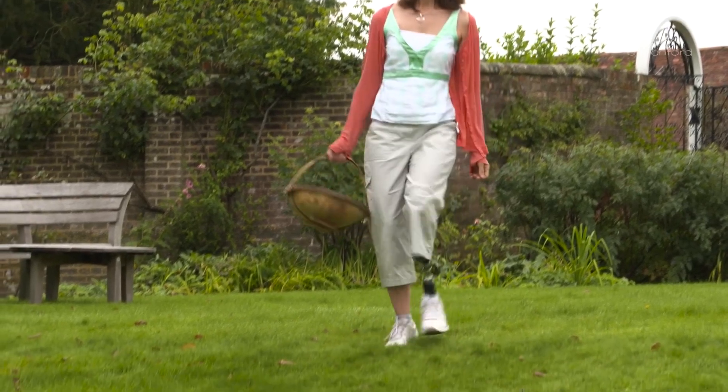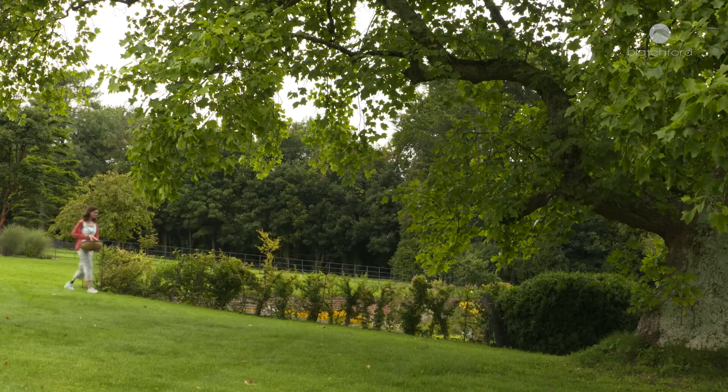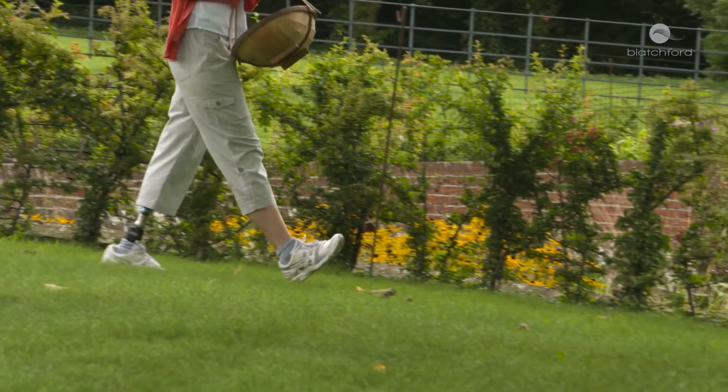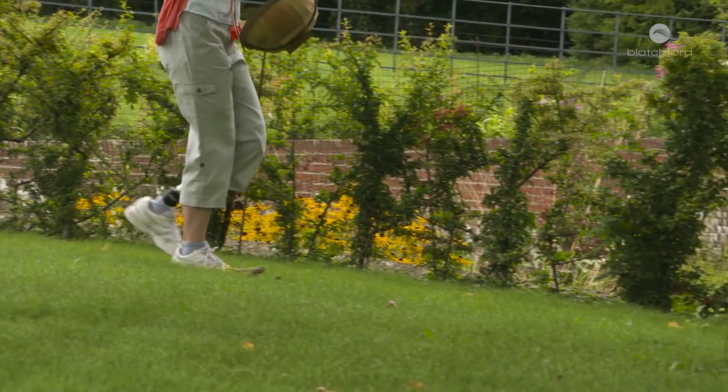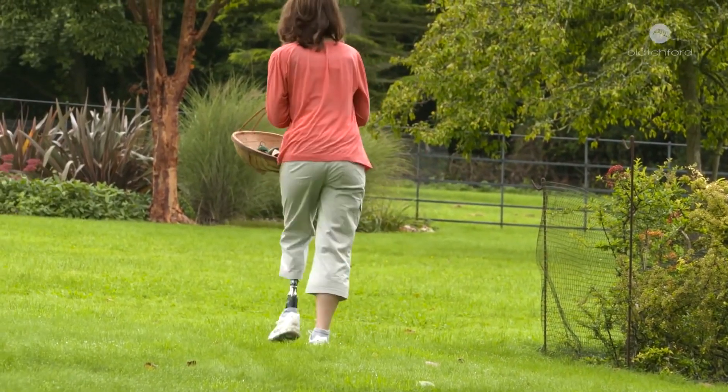Because you have that fluidity of movement going down and also going up, plus the boost you get from the ankle being stiff when going up and looser when going down, it's a much more natural movement. I don't have to do that mental preparation anymore — there's a slope, I know my ankle can accommodate it, and you just keep going.